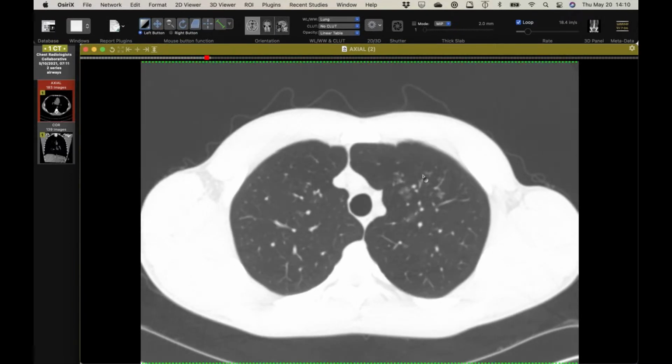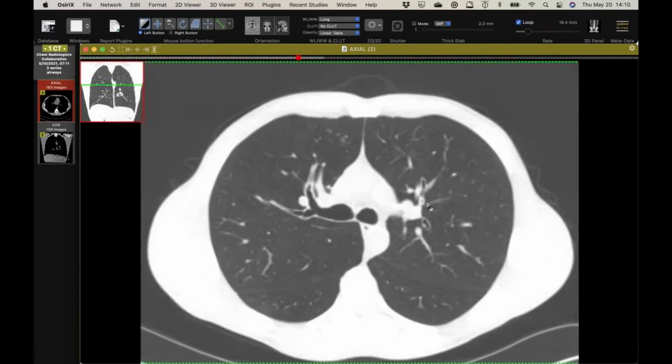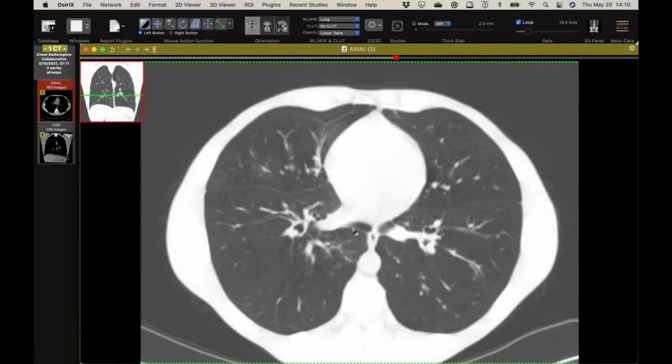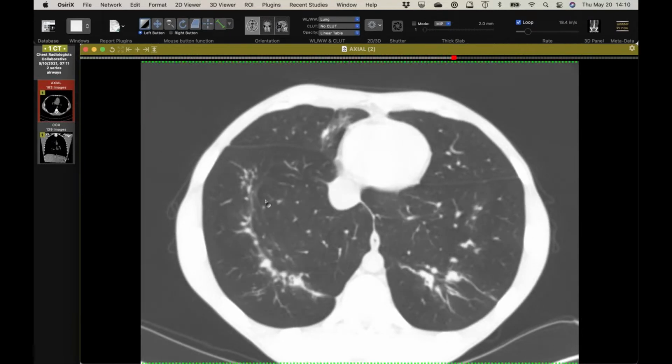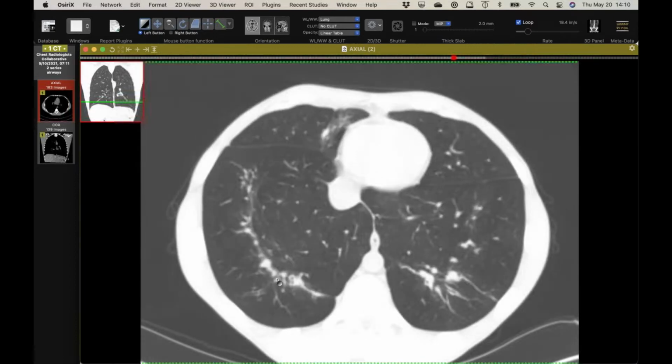And you can see the same kind of thing, albeit a lot less exuberant, little tree and bud. It's a little bit of bronchial wall thickening. These are thicker cuts, but I think you can still appreciate that. And as we go down, there's some mucus plugging, more small airways nodules, these interesting bands of atelectasis, but clearly another airway disease.